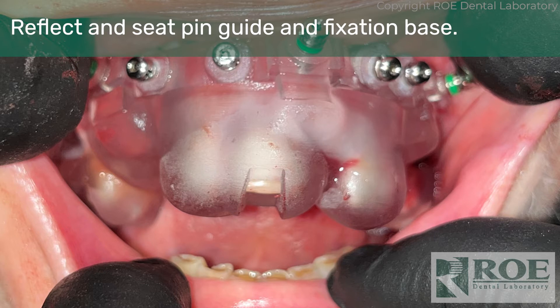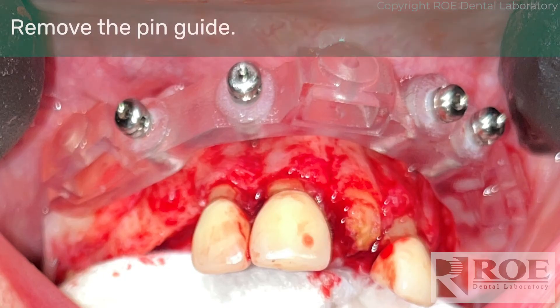The first step with this combination is to make a reflection, then seat the pin guide and fixation base together, then drill and seat. We have lots of videos on our website showing the process of seating and pinning — it's not complicated, but it helps to have the right tips and tools. Once seated, the pin guide delivery device is removed and the fixation base remains in the mouth the full time. This particular guide is plastic. Most of the time our combi guide is metal — metal osteotomy guide, metal fixation base. For this teaching case, Dr. Sullivan ordered both types and used plastic, which is perfectly fine. We make it a little thicker, about four and a half to five millimeters, so we have a nice robust plastic in the mouth.